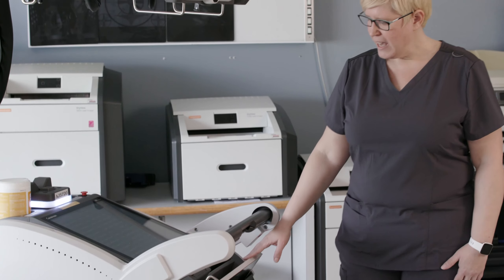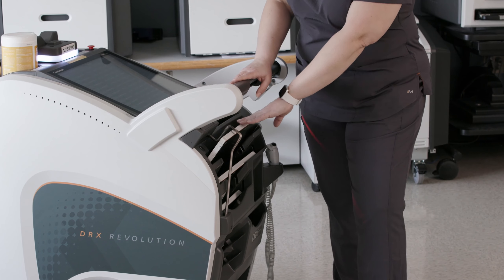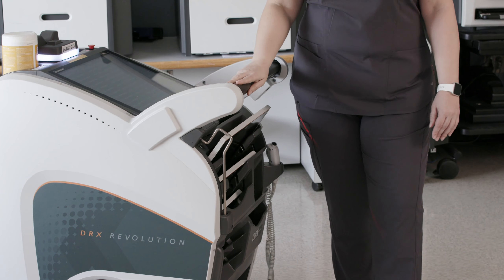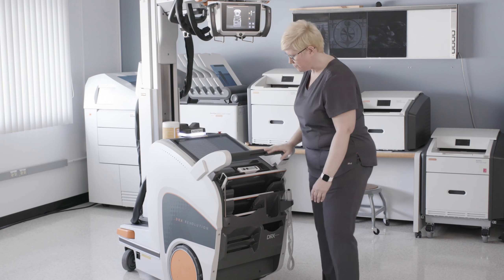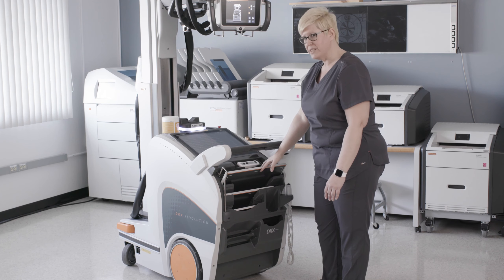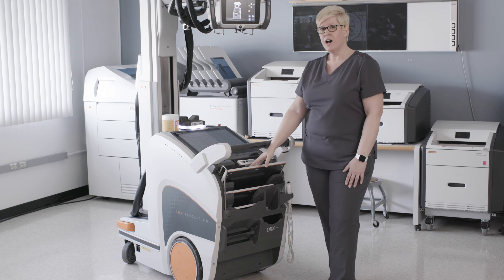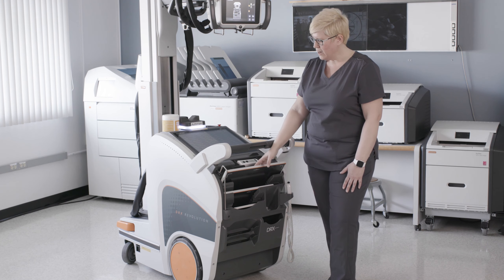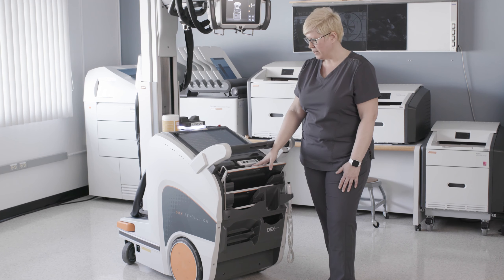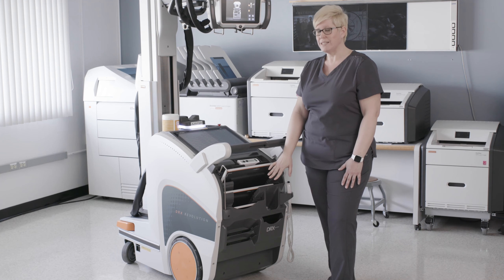The bin on the Revolution system has been redesigned. It now offers an optional detector bin lock, which eliminates the detectors from walking away when the Revolution cart is left unattended. We also allow you to store all three detector sizes: your 4343, your 3543, and your 2530 detectors all at the same time. Optionally, the first slot in the bin allows you to both store and charge either the 3543 or the 4343 detectors. At the bottom of the bin is a slot that allows you to store and charge two of your spare detector batteries.